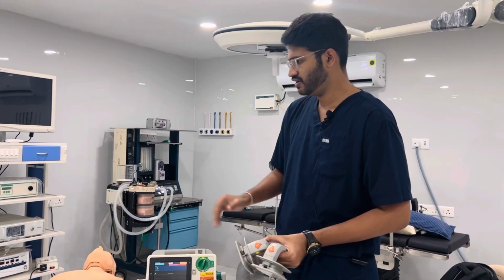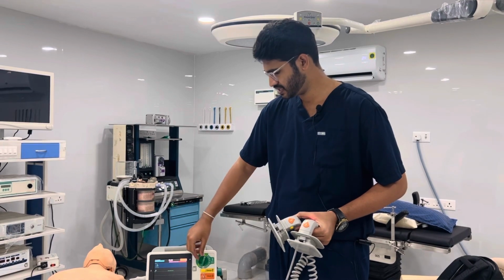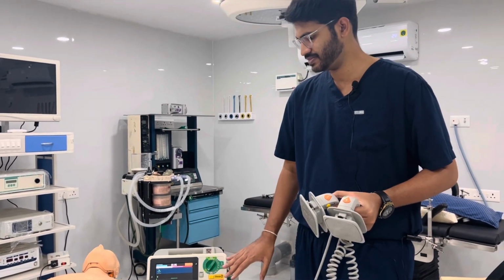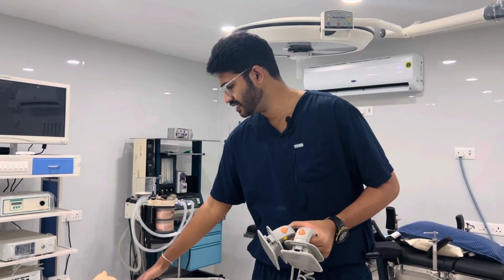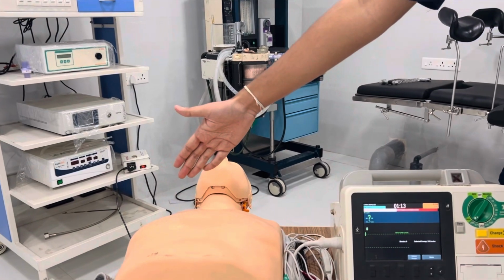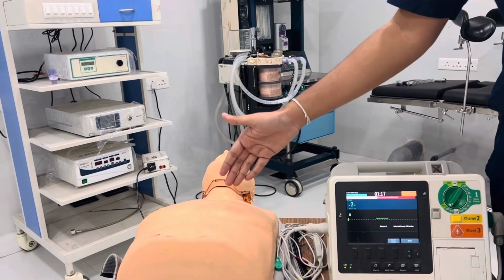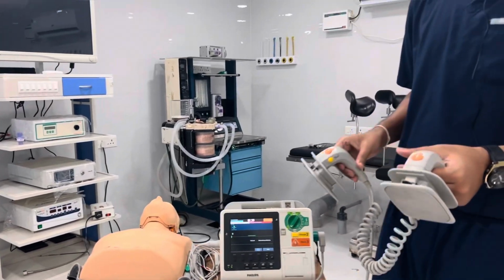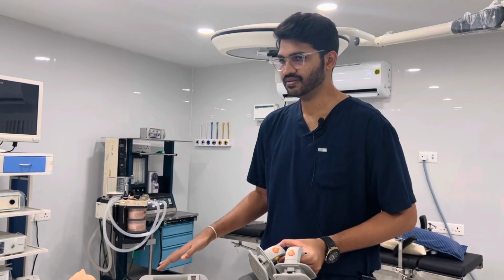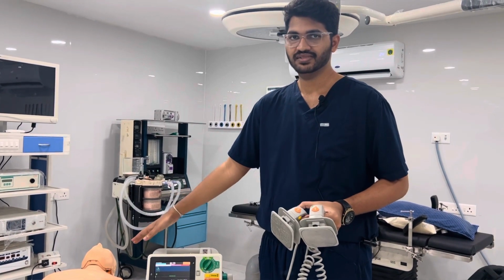When you find a patient with pulseless VT or VF, you have to select the maximum joules, which is 200. Before that, you have to apply the leads to the patient's chest. For example, red goes to the patient's right shoulder, yellow to the left shoulder, and green to the apex. These are the lead colors. Once you have connected the leads and found the rhythm is VT or VF, you have to check for the pulse as well.